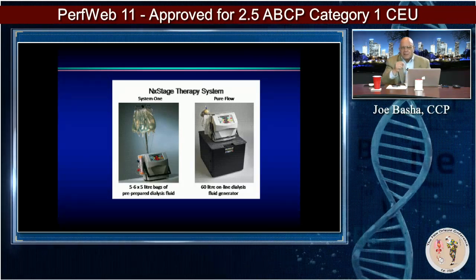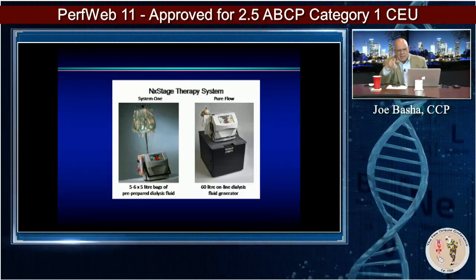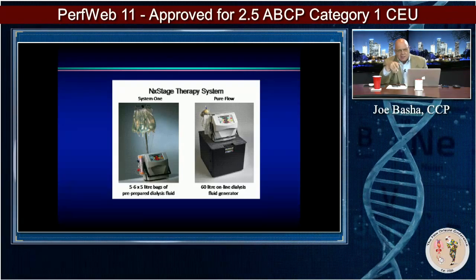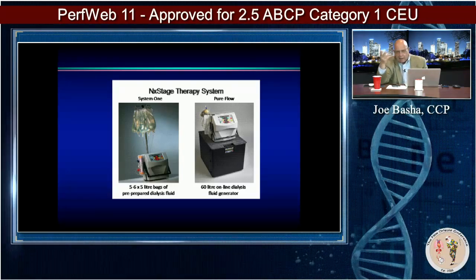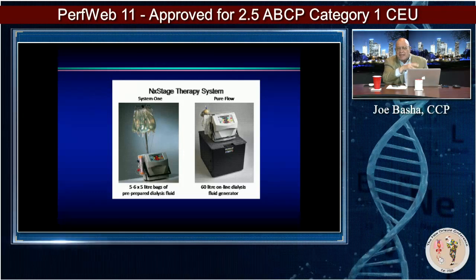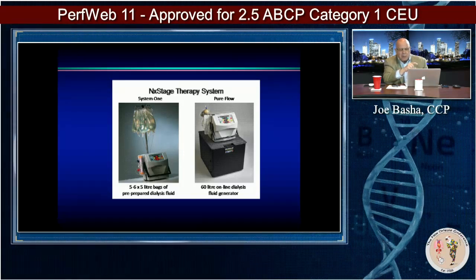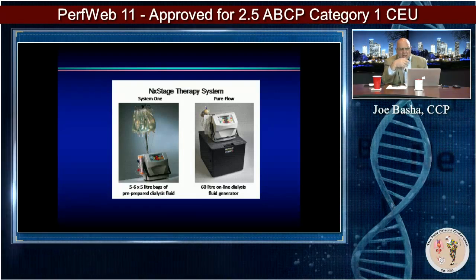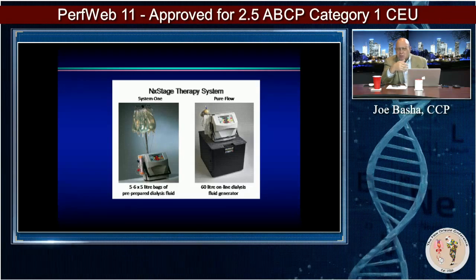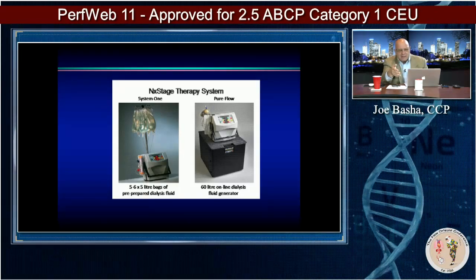But this is volumetric. Meaning that basically each pump has a stroke volume and it counts the strokes, it counts the number of RPMs, and it calculates the volume from that. Another potential advantage, which could also be a disadvantage, is that you put the waste into a sink, and so you don't have to change the waste bags all of the time. So it decreases the labor intensity of it.